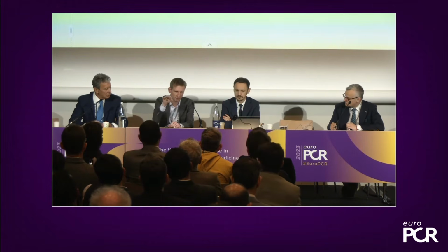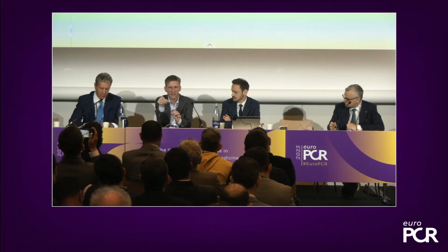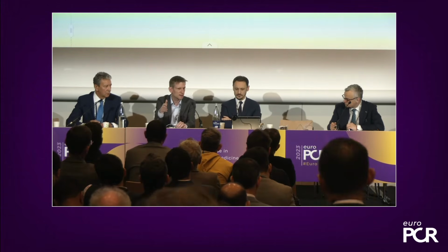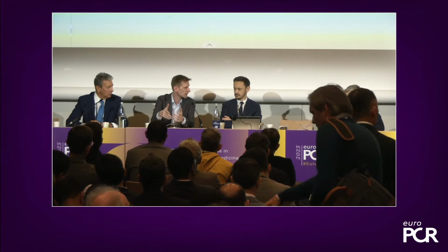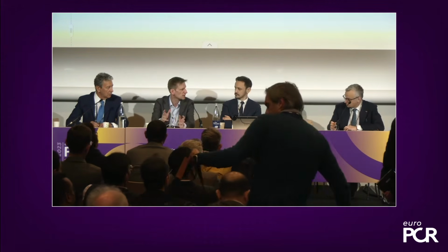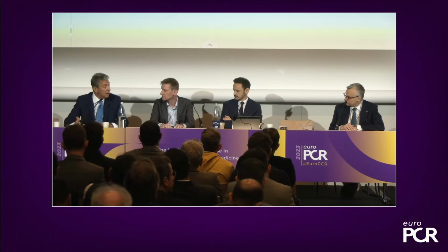If you go 45 degrees, you know you go 45 degrees. If you use a micropuncture needle and then make small adjustments, you actually make a not straight channel, and those are the cases where afterwards, if you want to go in with a sheath or with the probe, you get that S or a kink in the wire. So I'm not too big a fan anymore of these micropuncture needles. I don't know, maybe there's another opinion. No, exactly the same.